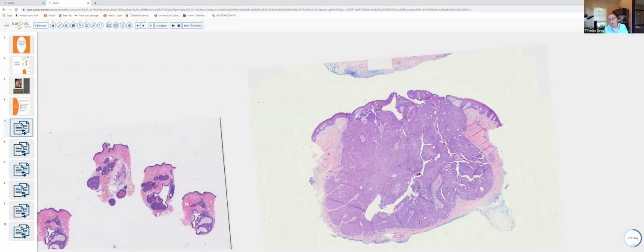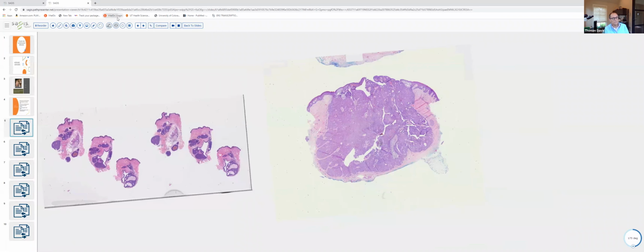Now, the epidermal connection, which we don't see in the dermal duct tumor, but we do see in the hidradenoma, can be quite small. And these, of course, are three-dimensional tumors. So if you happen to get a section cut near the edge of the tumor, you may not see that epidermal connection, but typically they do show attachment to the overlying epidermis. So that's a difference between the two of them that I think is best appreciated at low power.